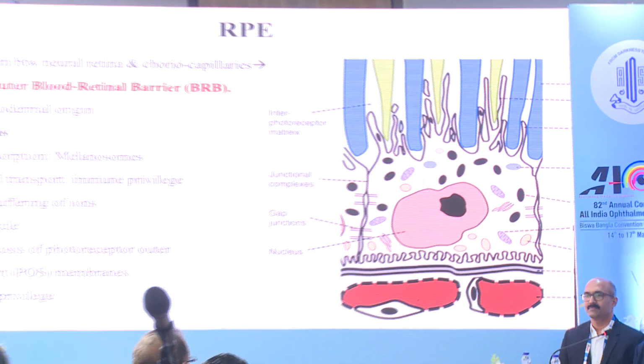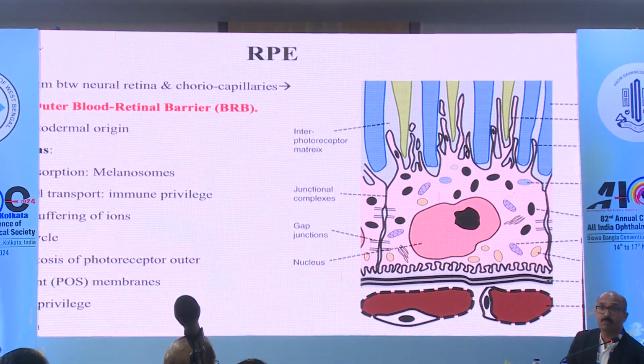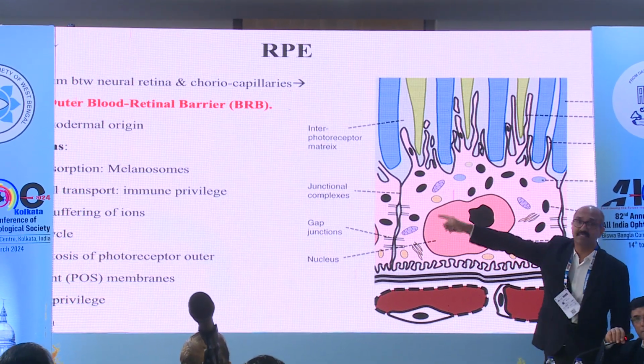We all know that because of the better understanding of the chorioretinal disorders, that RPE is not. The image is not coming. Audio visual. Excuse me, the image is out.